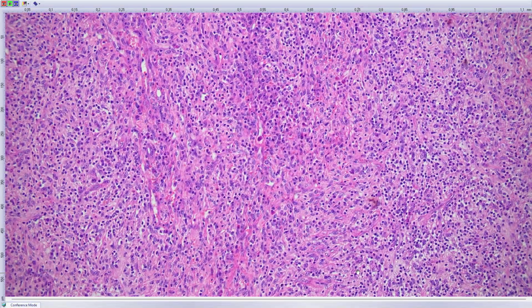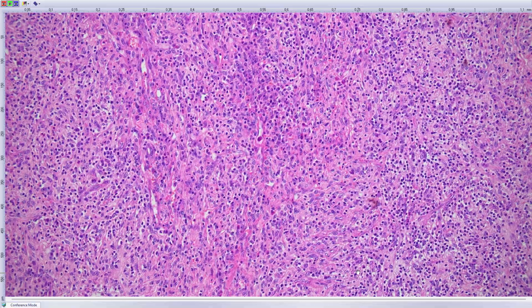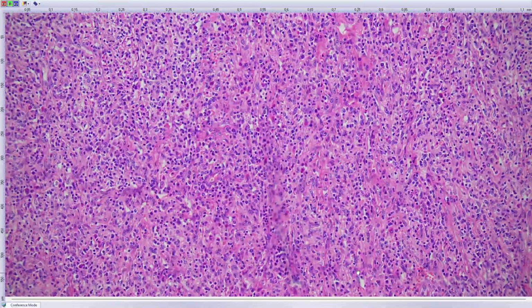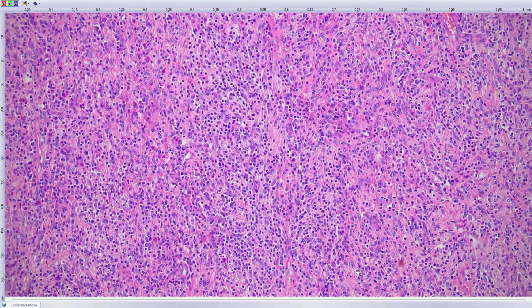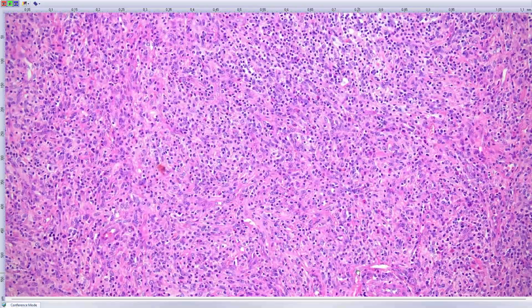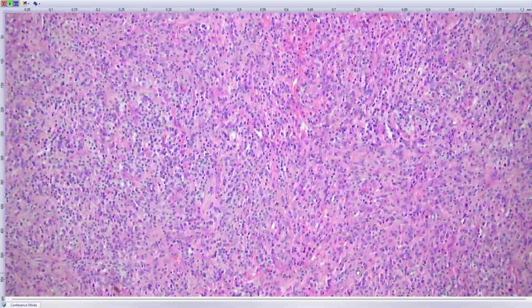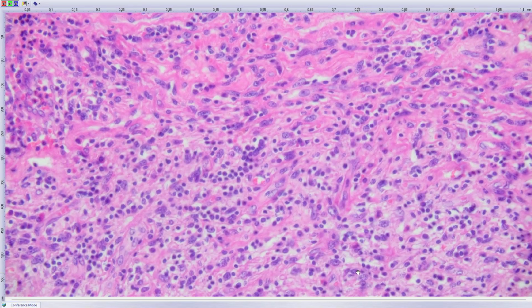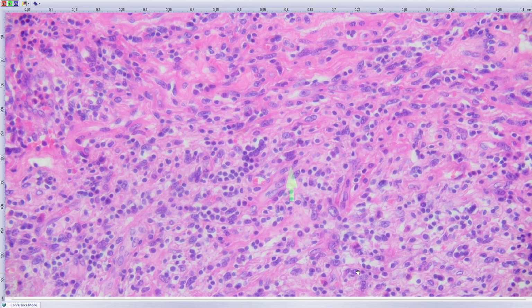So you do CD21, CD23 for follicular dendritic cells. Perfect. Yes. That was my suggestion number 2. Inflammatory pseudotumor something? Yeah, that we also did in the differential, but in the radix of mesentery with this morphology, just purely by statistics, I stained MDM2 for dedifferentiated liposarcoma. You can always have so much inflammation there, and you see these sometimes quite hyperchromatic spindle cells in the background, which you typically see in dedifferentiated liposarcoma.